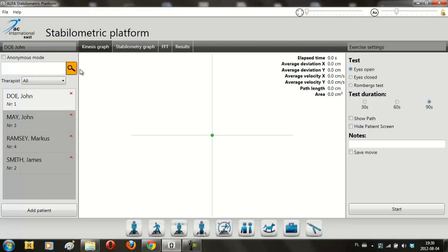On the left side we see the database of the patient. On the right side we see the box with settings of exercises and tests. The lower part contains modules which can be chosen: tests, exercises, games, patient database and reports. In the middle part we see the biofeedback information for the patient. During normal work, this part of the screen is visible on the second monitor dedicated to the patient. The outer elements of the main window are visible only to the therapist on a laptop.